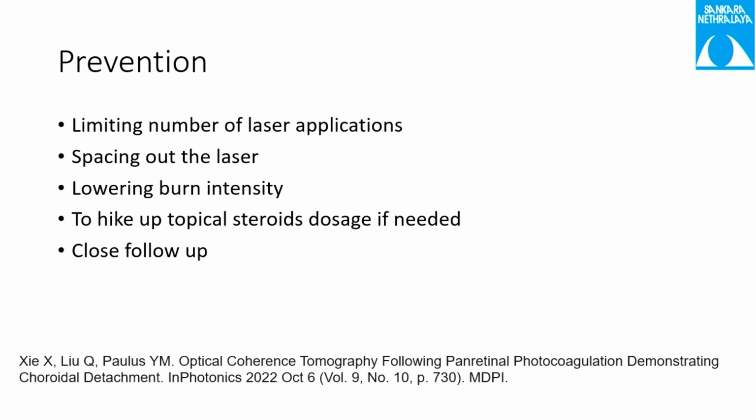1500, it's better. 1200, somewhere between 1200 to 1500. Try to space out the laser, and try not to complete it in a single setting. That is the most important thing. Avoid putting heavy burns, and try to use low burn intensity while applying laser burns.